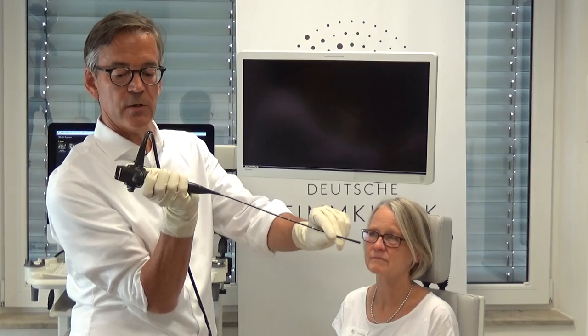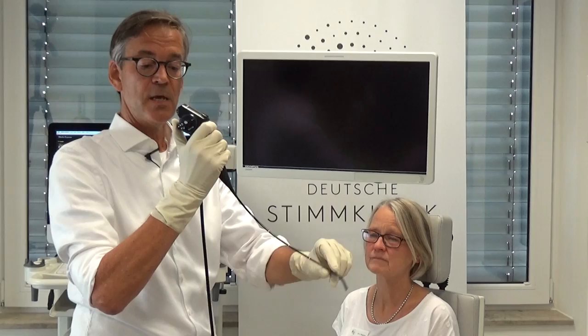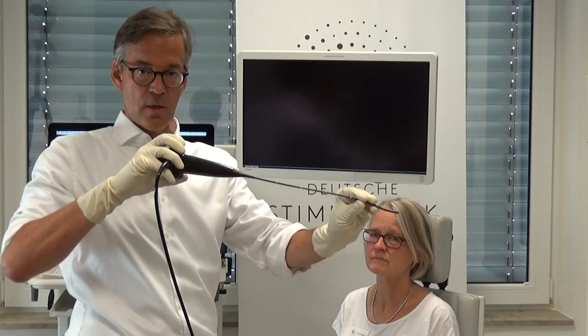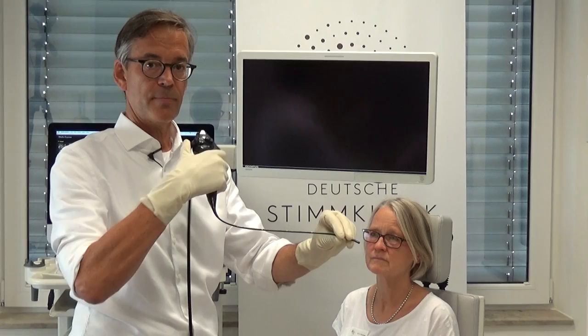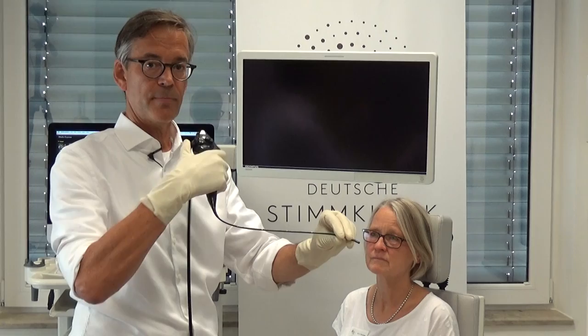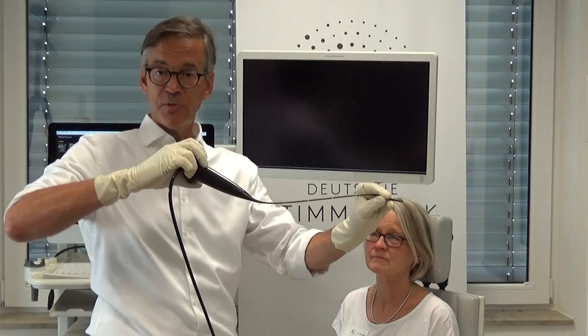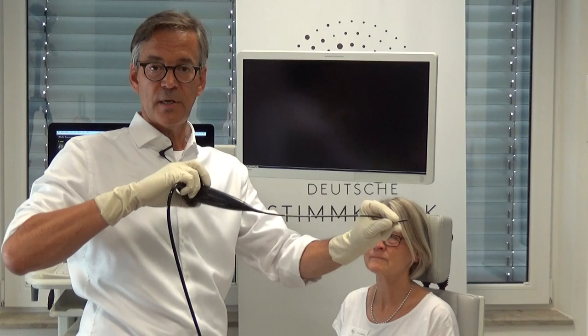If I start here that would be 180 degrees, but nobody starts like that — everybody starts from the neutral position. That means 90 degrees plus 90 degrees is fine for a couple of movements, but not for rotation. For rotation you need a starting position of zero degrees so you can easily go to 180 degrees. These endoscopes are not made for ENT doctors in the first place, but they are great endoscopes if you adapt your handling to the range of motion of your arm and hand.